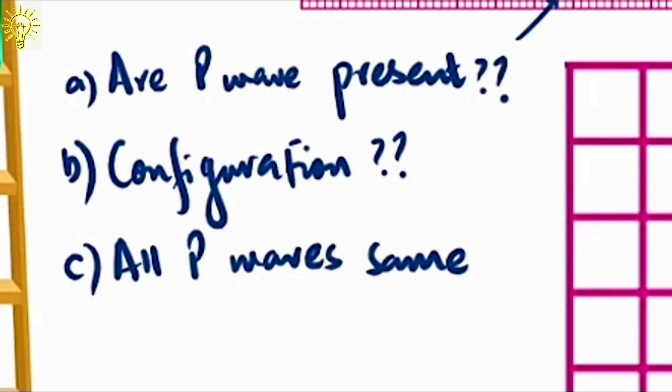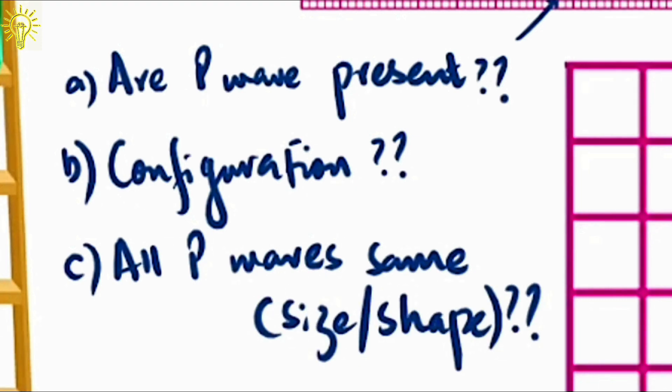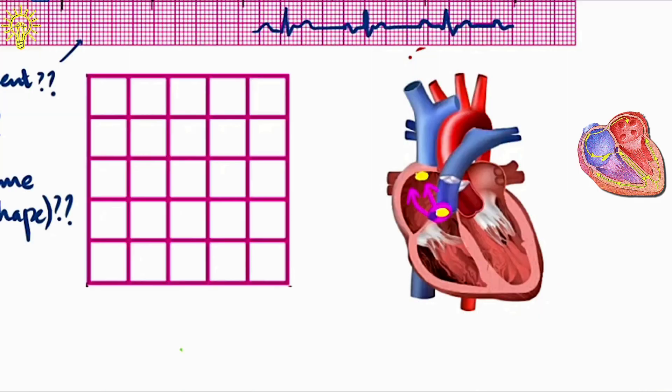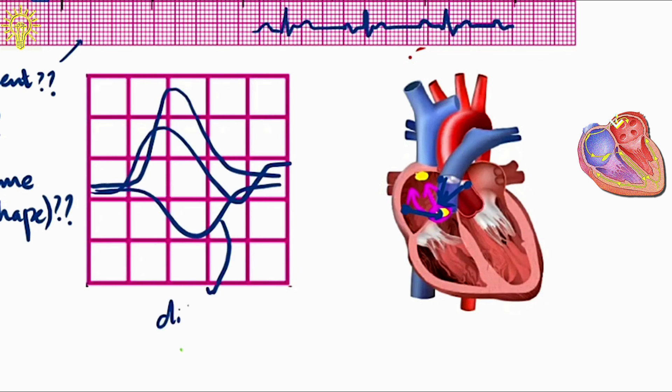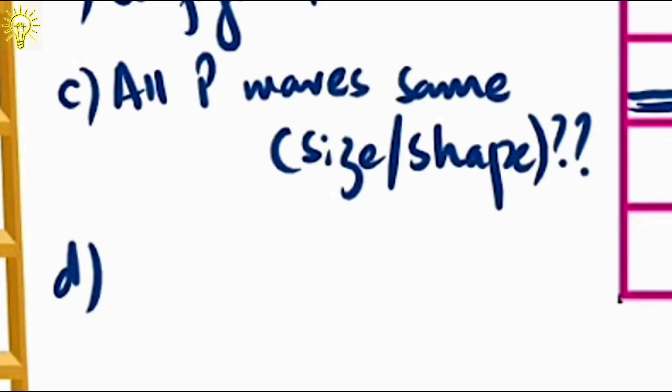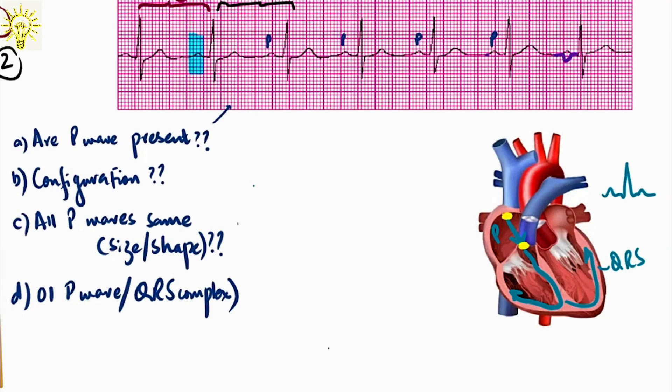Third question you must ask is, are all P waves similar? For example, if you see different shapes and sizes like positive, biphasic, negative, it means there are multiple sites of origin of impulse, which happens in multifocal atrial tachycardias. Finally, ask yourself, is there a P wave for every QRS complex? In the waveform in blue, you can see a P wave before QRS but one isolated P wave that did not generate a QRS. This means a drop beat, which happens when impulse coming from SA node is blocked at AV node. In other words, a heart block.